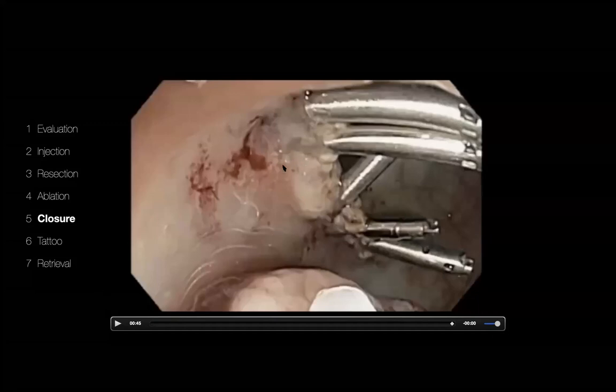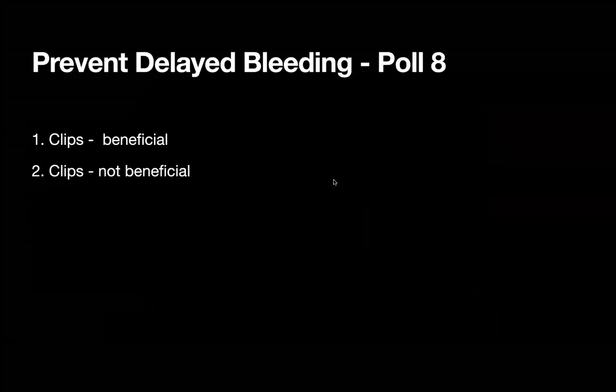And in rectal lesions like this, you really don't need to put a tattoo. You can describe your lesion in relation to the first or second Houston fold and the distance from the anal canal. You don't need to put a tattoo in the cecum either, but anywhere above the rectum and other than the cecum, you should put a tattoo. So we didn't put a tattoo, and I would let this go here.